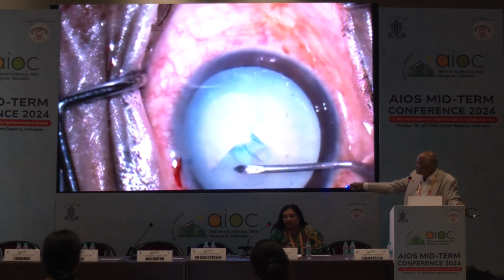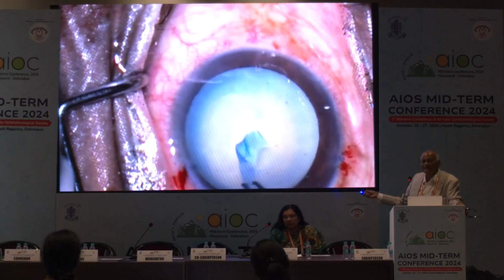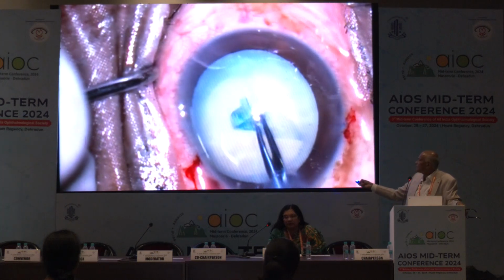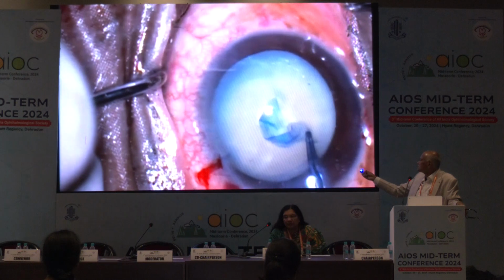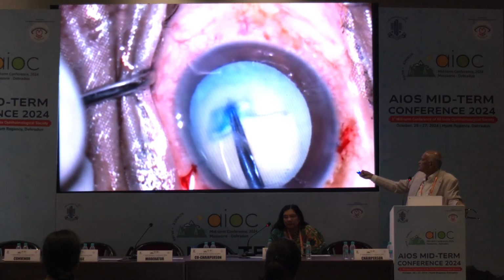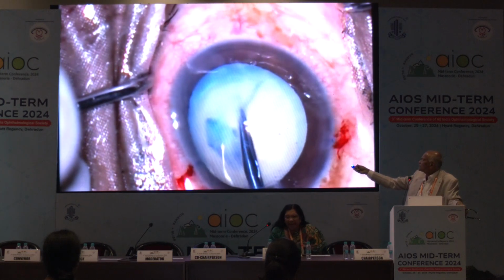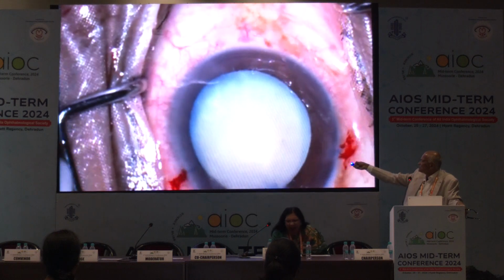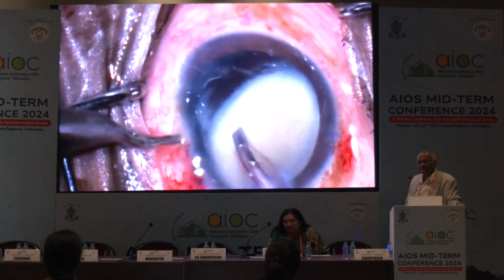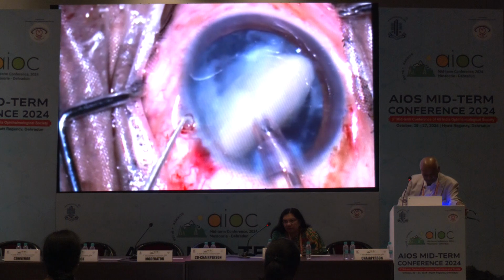Now see here. When I am trying to do here, always remember, don't go beyond that. That is the limit. Then you will have to go with the forceps, and with the forceps, you will have to see here. Again you can see I am going here, and with the forceps, you are very much away from that. Again rehold it, and once you rehold it, that is going to be larger. So why was it larger? Because of the fibrosis of this one.